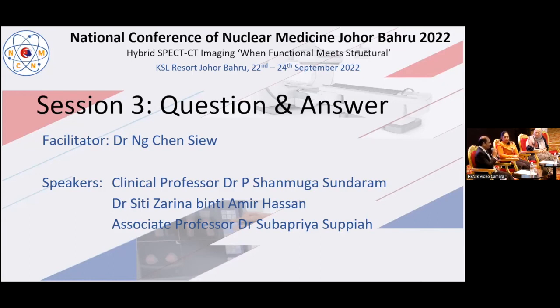As we know already, SUV is highly variable: inter-observer variability, inter-institutional variability, inter-equipment variability, so many variabilities are there. So we need to keep in mind that if we are going to do a contrast enhanced CT, and when we are doing the follow-up also, majority of the time, especially in liver tumors, we do it as a contrast enhanced CT.